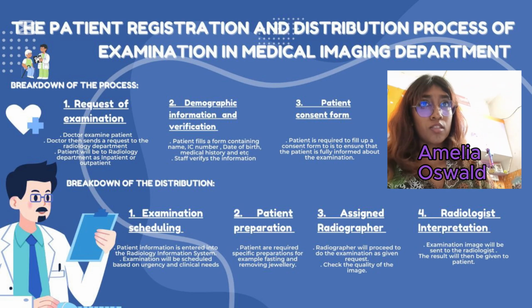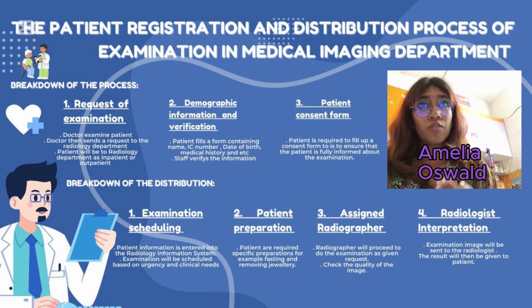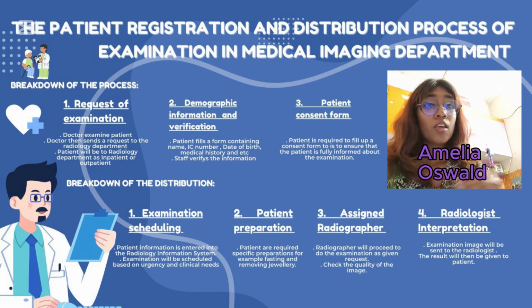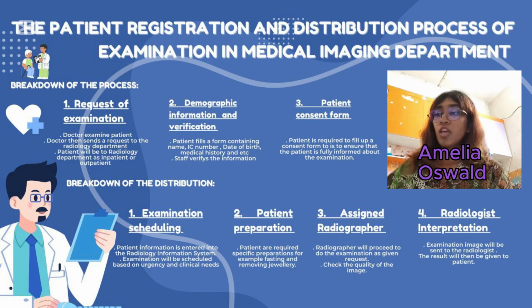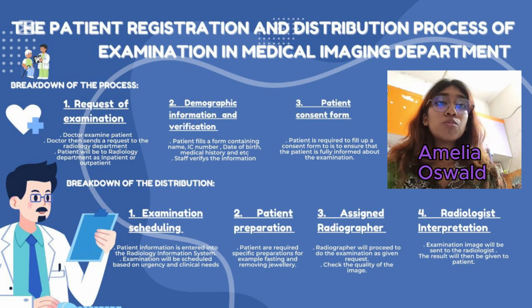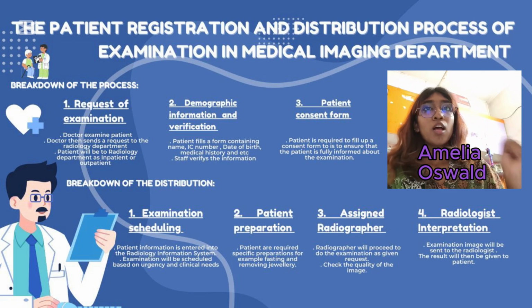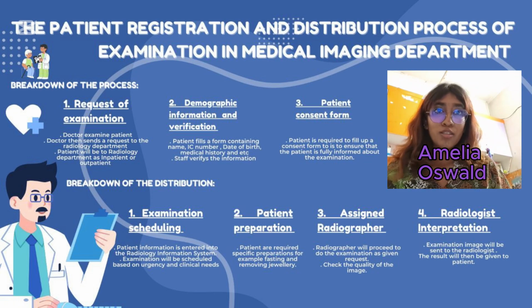The qualified radiographer will then perform the examination. Once the examination is completed, the X-ray image is processed and reviewed by the radiographer. Why? It is because to check the quality and also to make sure that the image is clear for the interpretation.